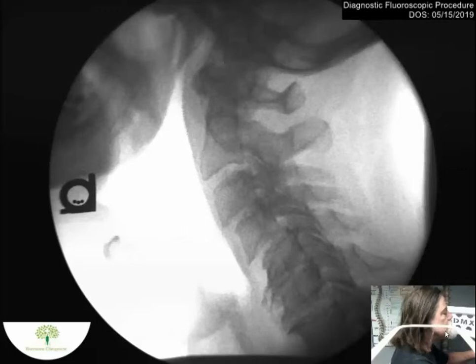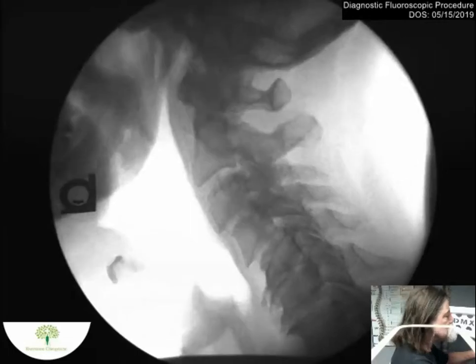We also have the picture over here of the patient. This allows us for patient identification. We can see how they're moving. If they do have pain, we can pick that up as well, and also trace it right into their x-ray. So let me hit play here and you'll get to see the patient looking up and down.